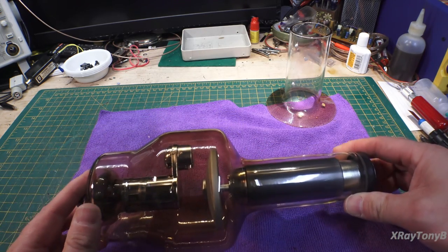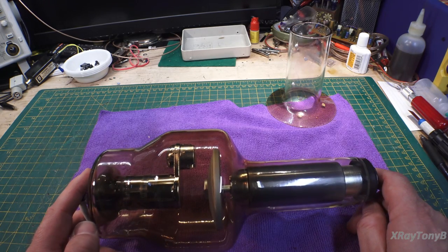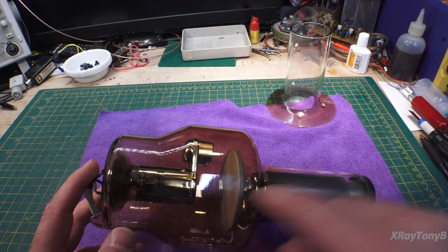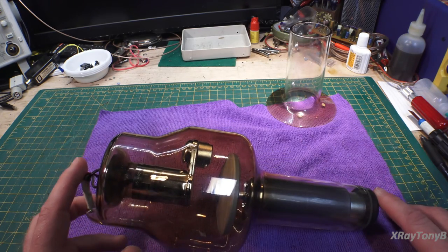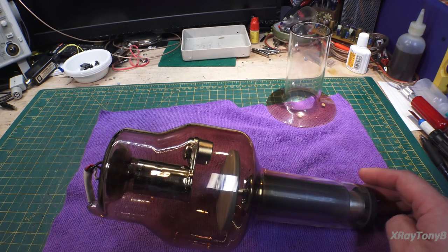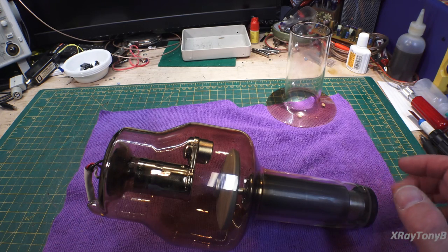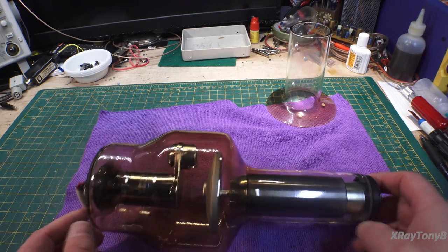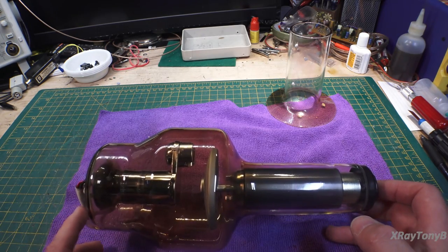If you look inside of here, this is what we would consider a diode tube, so it only has two elements. It has an anode and a cathode. The anode is this round disc over here. It's a big old thing. And this is a small x-ray tube that you'd see on a small radiographic x-ray machine. If you were looking at a CAT scanner or a cardiac catheterization lab, anything like that, they're much larger than this tube. This particular one can handle up to 125,000 volts or 125 kV.